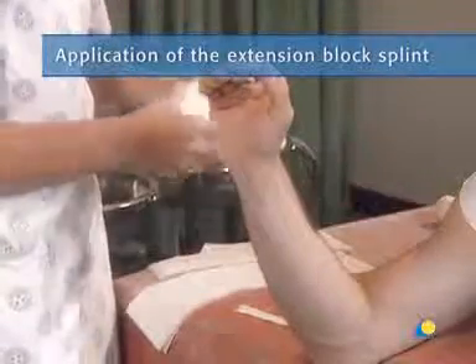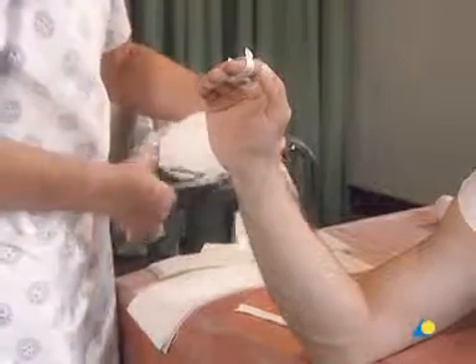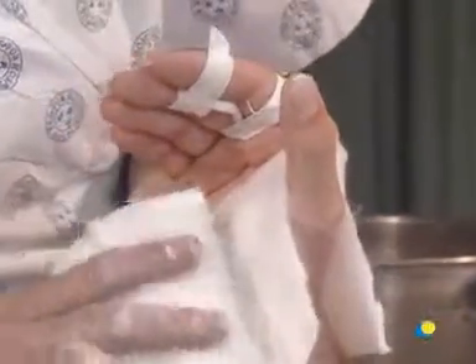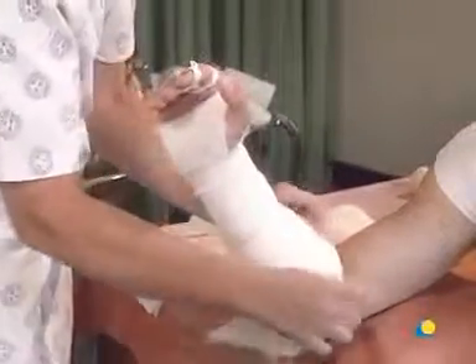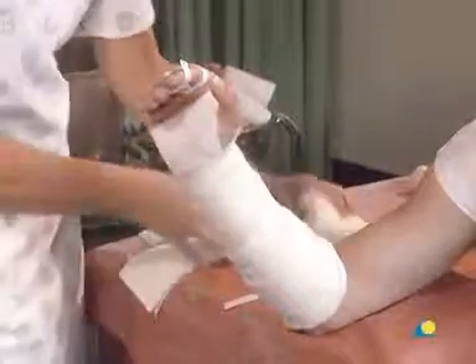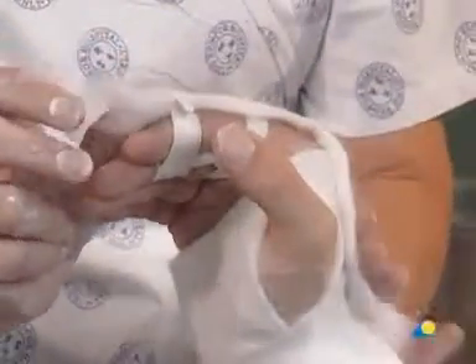The cotton wool is used for undercast padding. A slit is cut in the cotton wool for the first web space. The cotton wool is gently wound on towards the elbow with an overlap of 50 percent, which creates a double layer of padding. The proximal border of the extension block splint is about two fingers below the crease of the elbow. The cotton wool extends slightly beyond the planned edge of the slab to provide a soft edge. Two strips of cotton wool are placed over the fingers.